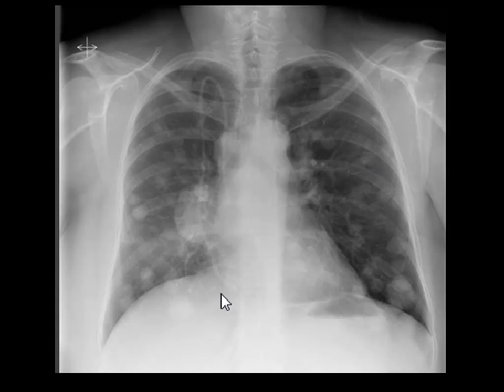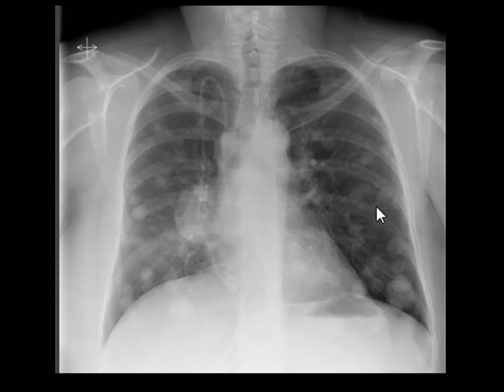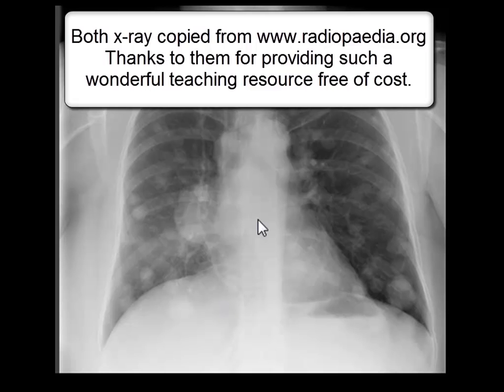Here is another example showing multiple small round lesions in both lungs. You can also see a catheter. In this case, the metastases are from a primary cancer of the breast.